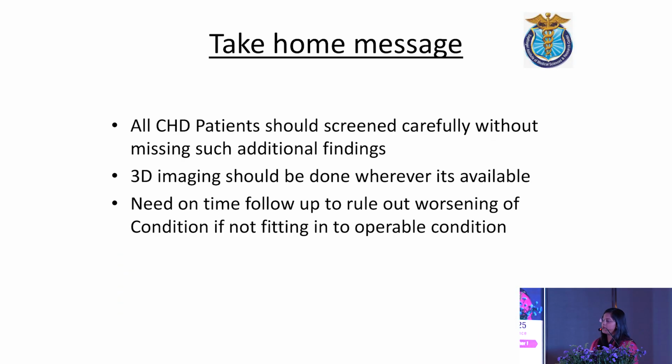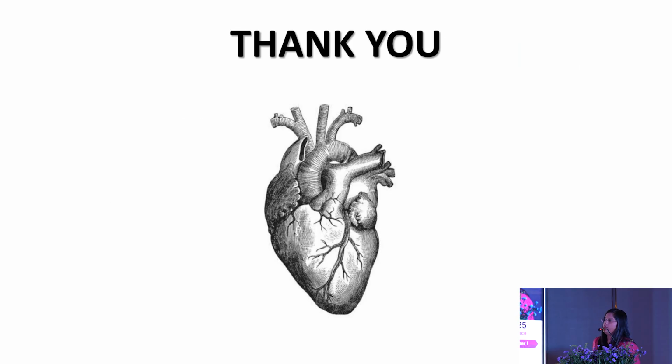Take-home messages: all congenital patients should be screened carefully without missing such additional findings. 3D imaging should be done wherever it is available. On-time follow-up is needed to rule out worsening of the condition. Thank you, one and all.